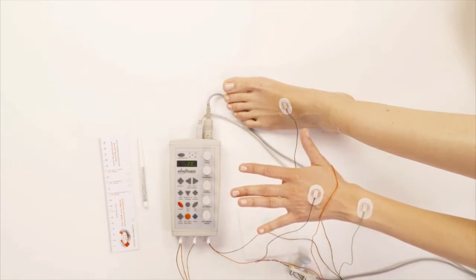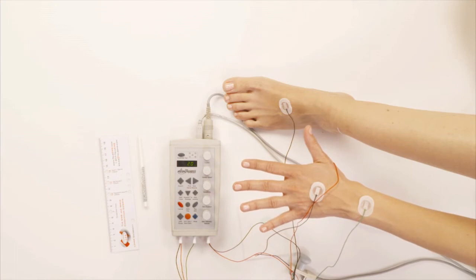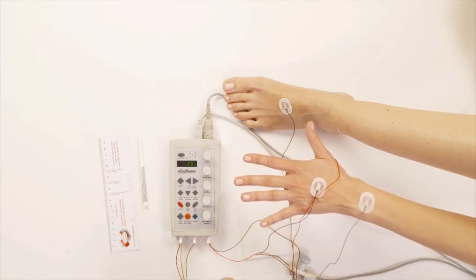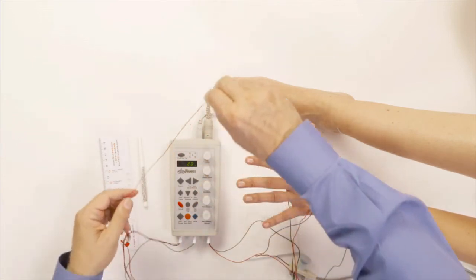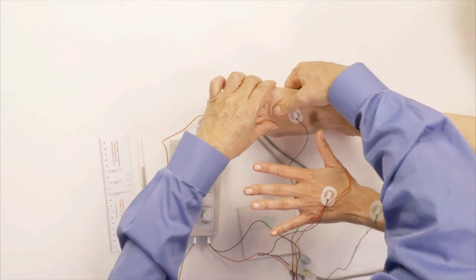And the red electrode is going to go, again, there's no need to put the green electrode because we already have one green electrode in place. And so the red electrode, the reference electrode, I'm just going to put like this at the bottom of the foot. You can't see it, but it is at the bottom of the foot.